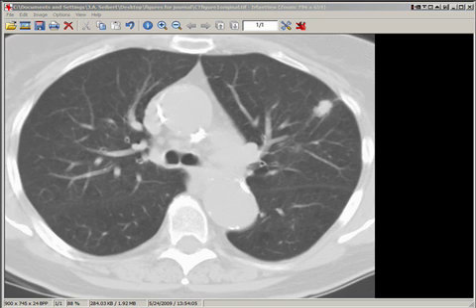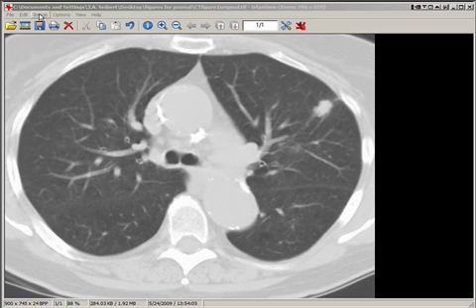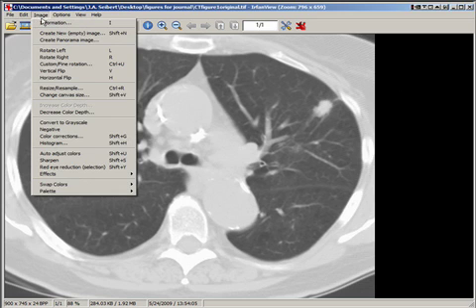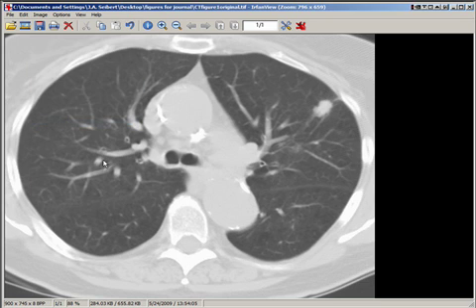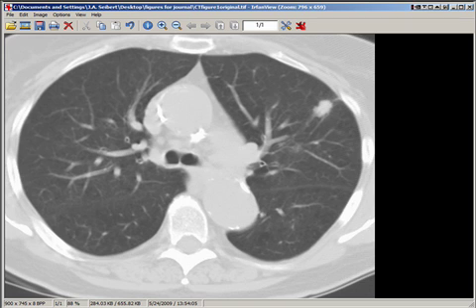Even though the appearance of the image appears to be unchanged, it now has the characteristics required by the journal. However, since the image only has grayscale content, one can also convert the image to grayscale by using the Image tab and going to Convert to Grayscale. Notice that now we have 8 bits per pixel, which is perfectly adequate for rendering grayscale characteristics within the image.